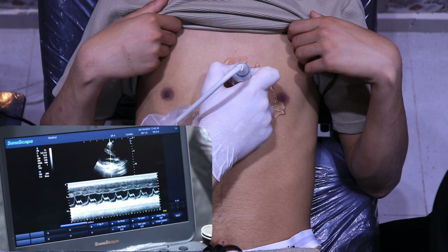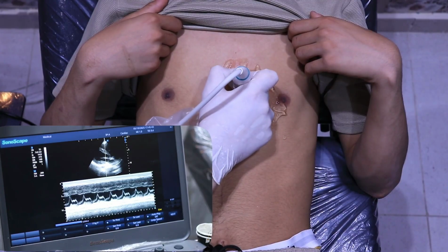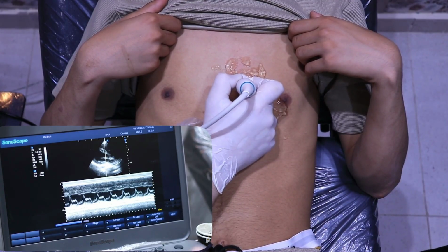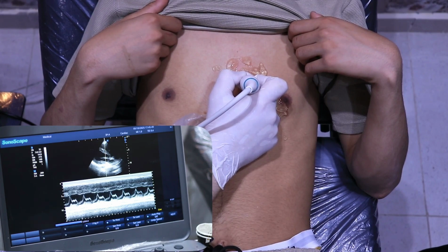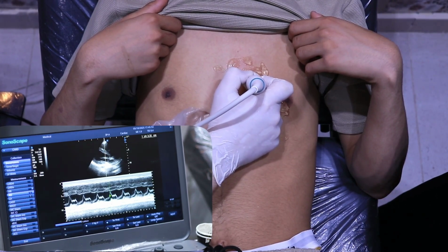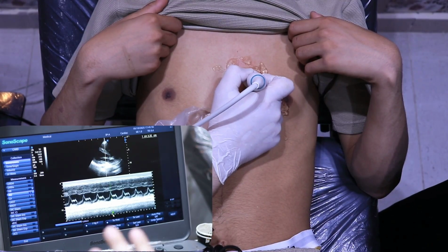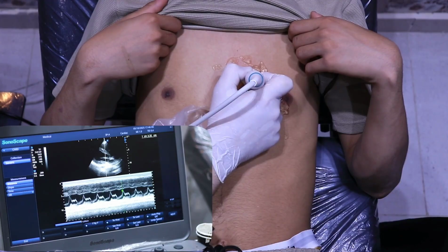That's why the doctor here is telling us the cardiologists are making up the measurements, right? So you can see it yourself. So the EPSS, here EPSS is not present, so we'll take the caliper. Okay, so the caliper, this is the distance between the E.